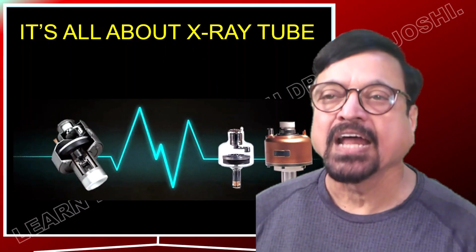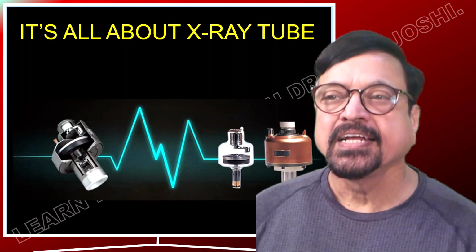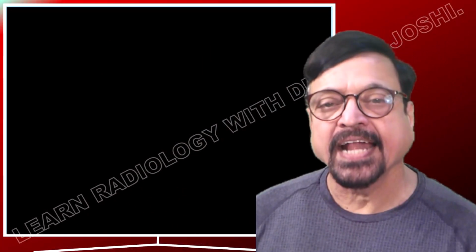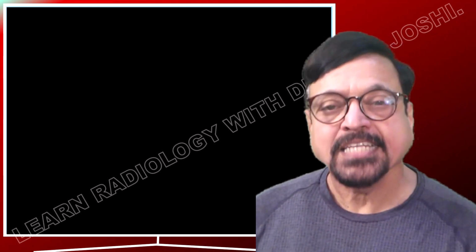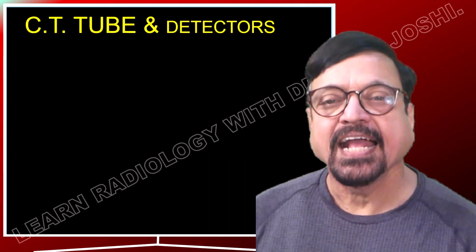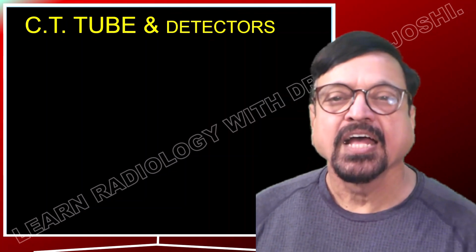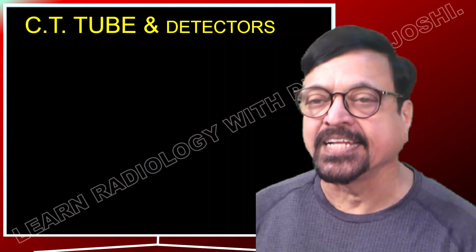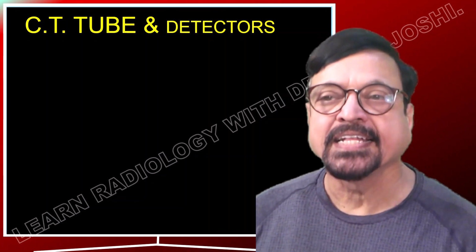CT tubes, and how they are constituted. It's all about CT tubes today. Actually, between CT tubes and X-ray tubes there is not much difference as far as the basic principle is concerned. Both convert electricity into X-ray energy. However, CT tubes need a larger capacity for heat dissipation and production of X-rays, while X-ray tubes for radiological purposes don't need that much.